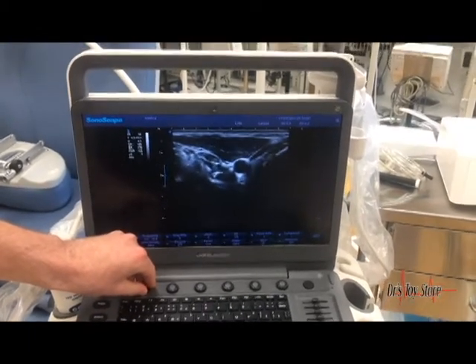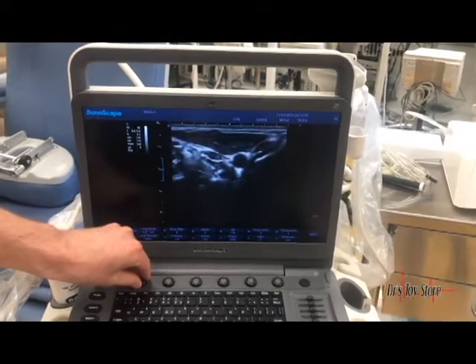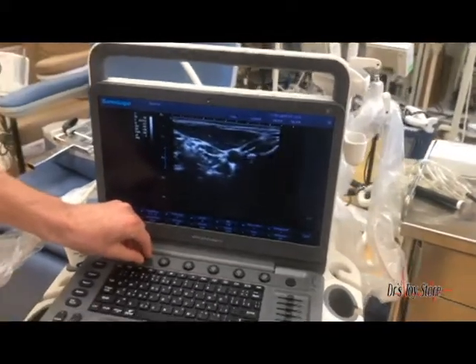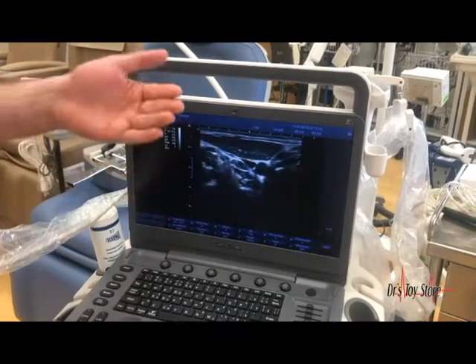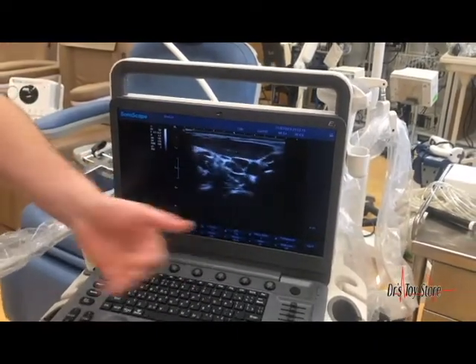These systems are very, very versatile. They can be programmed to change the frequency of the probe so you can get a more superficial image or a deeper image.